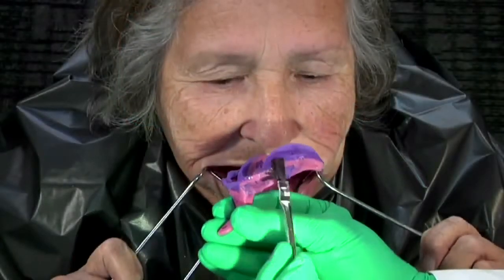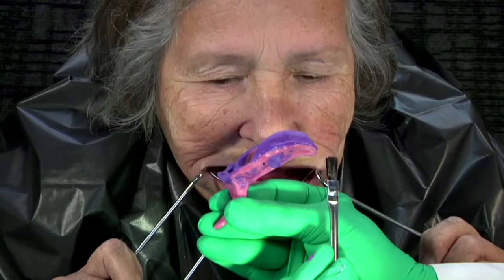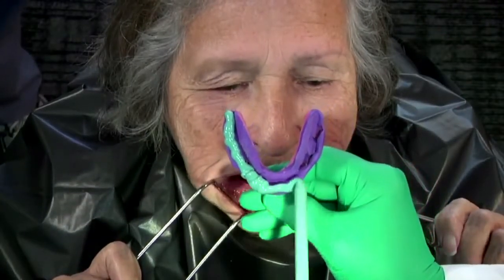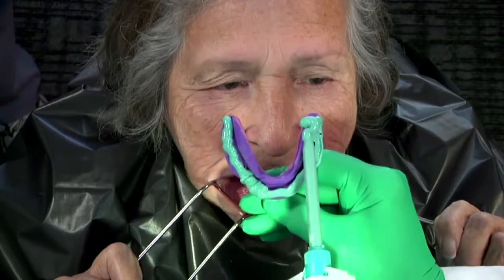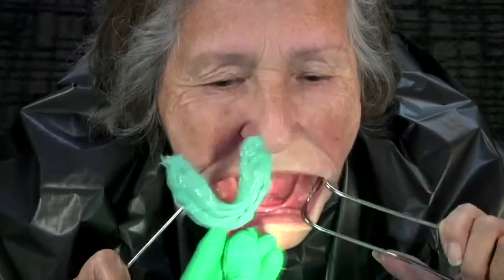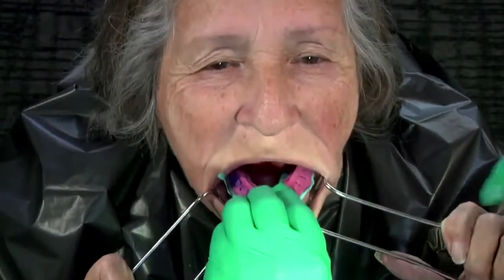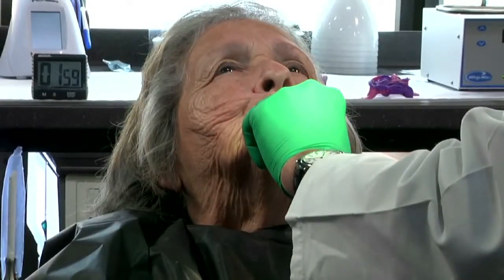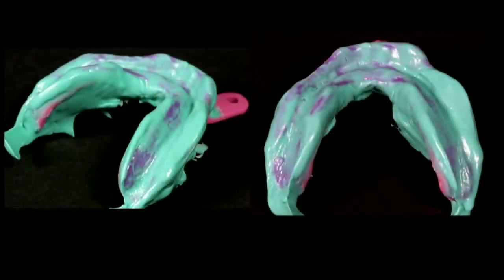Apply adhesive to any exposed tray area. The tray must be dry between applications of impression material. Finally, apply a medium or light viscosity polyvinyl siloxane impression material around the tray and on the peripheral areas. Insert back into the mouth. Repeat border molding. Remove and observe the mandibular impression. Evaluate the final detail of the mandibular impression.